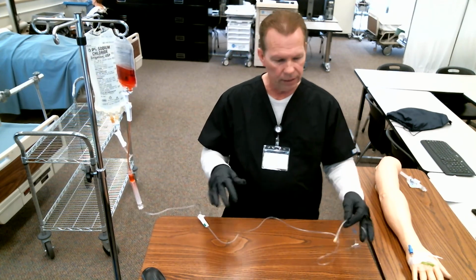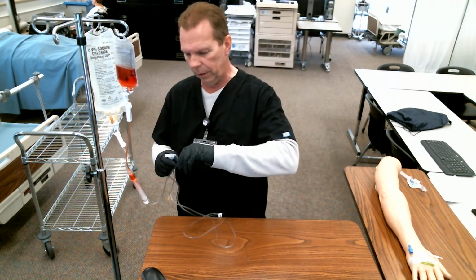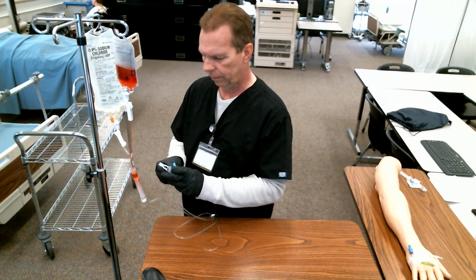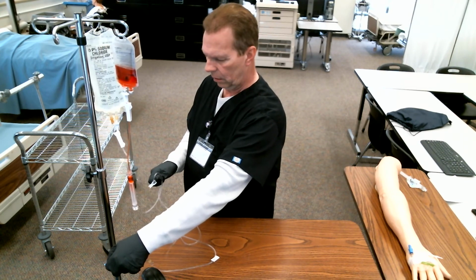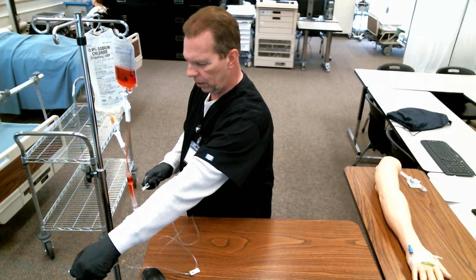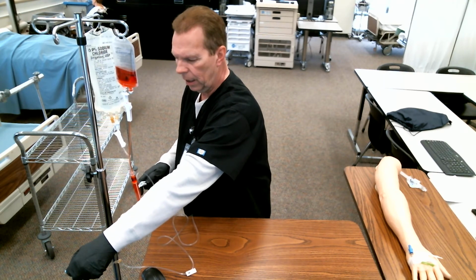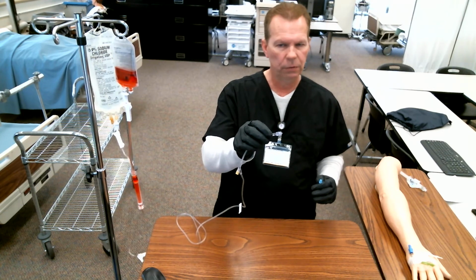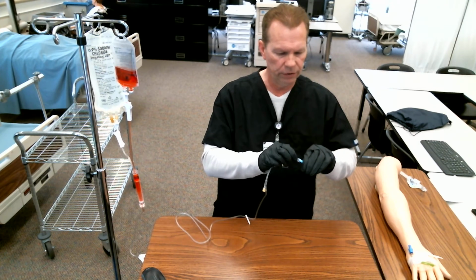I like to go ahead and then purge my line again to get the blood down there. So I usually go ahead and open this up one more time. It's going to fight me here. And get that going through there. And of course, this is a little bit light, so it's hard to see that the red tint is going through on the TV. But anyway, I go ahead and run the blood through there, get it all the way down in my tubing, up to about right there. Don't let any blood run out into the trash can or anything like that. Don't do that. But run it down to about the hard plastic surface there.